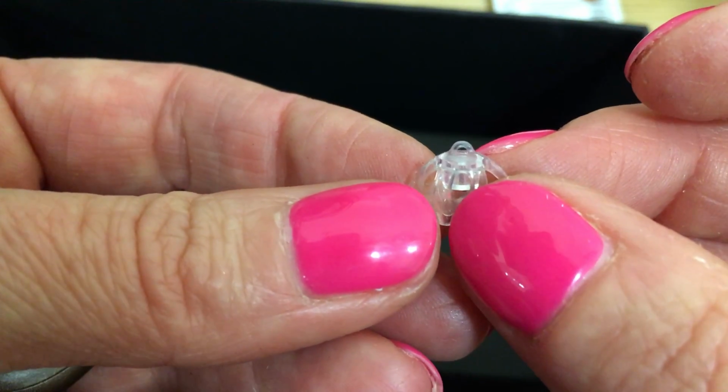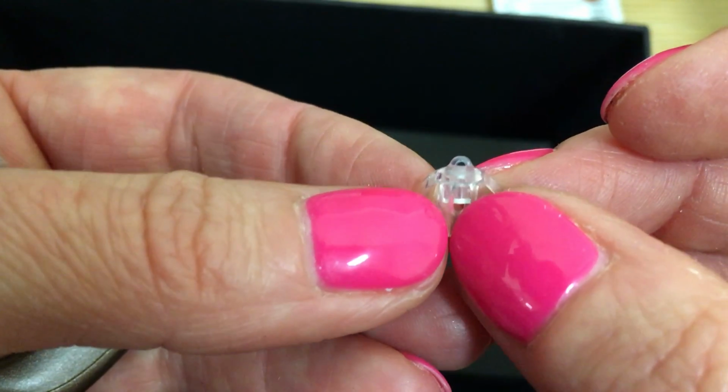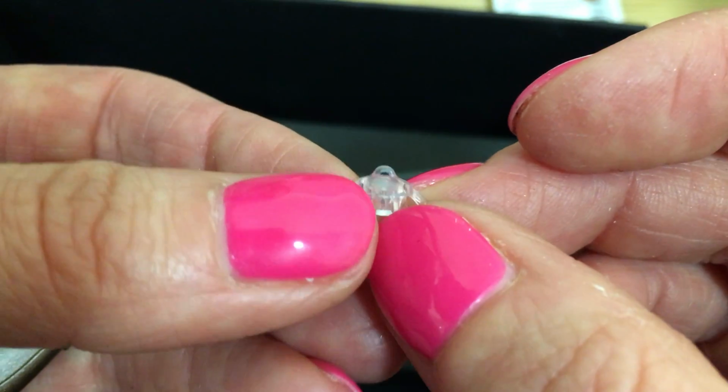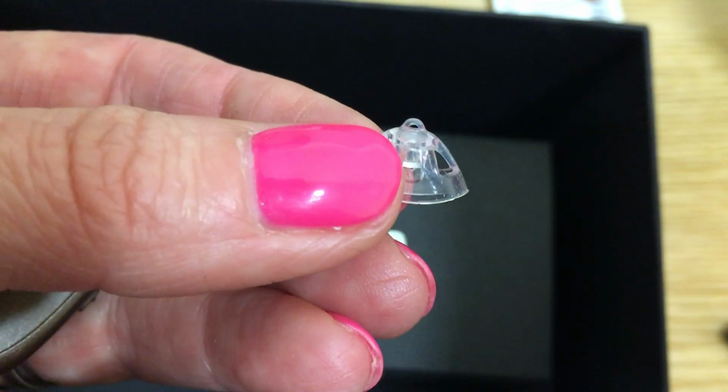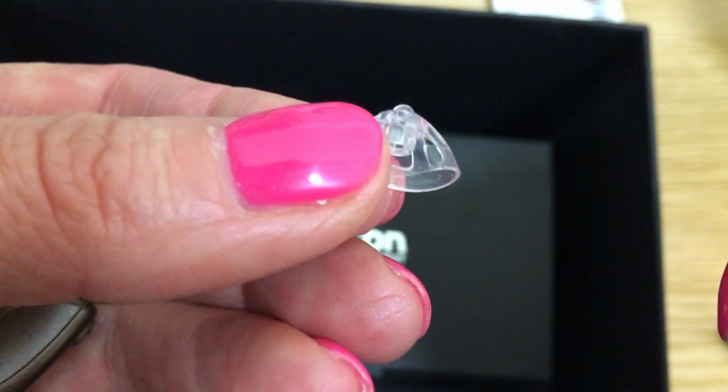At the very top of the dome is a tiny little loop which helps prevent wax ingress, and also allows the sound to come out. So it's always important to check this little end is clear.